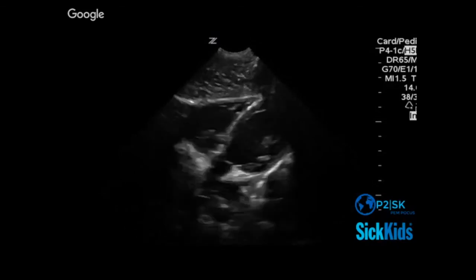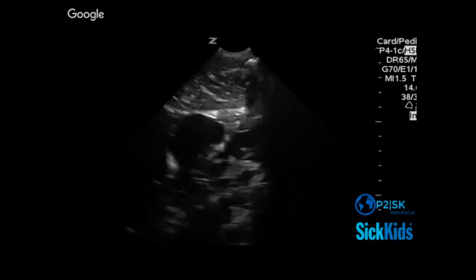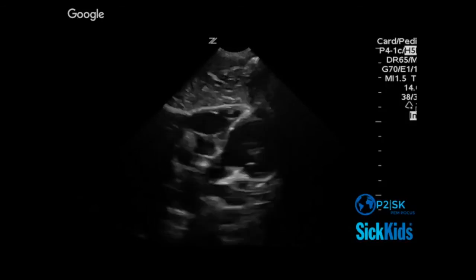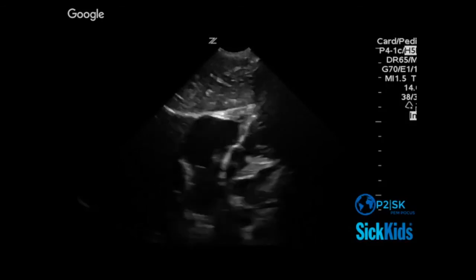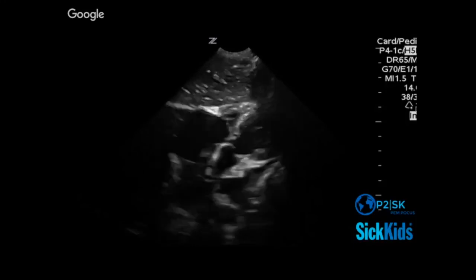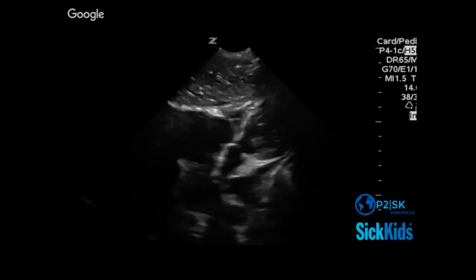And then what view of the heart are we looking at here? Subxiphoid, which is your best view for? Effusion. Do we see a pericardial effusion? Oh, we've got a very expert opinion that says this is a limited view, and they're right.